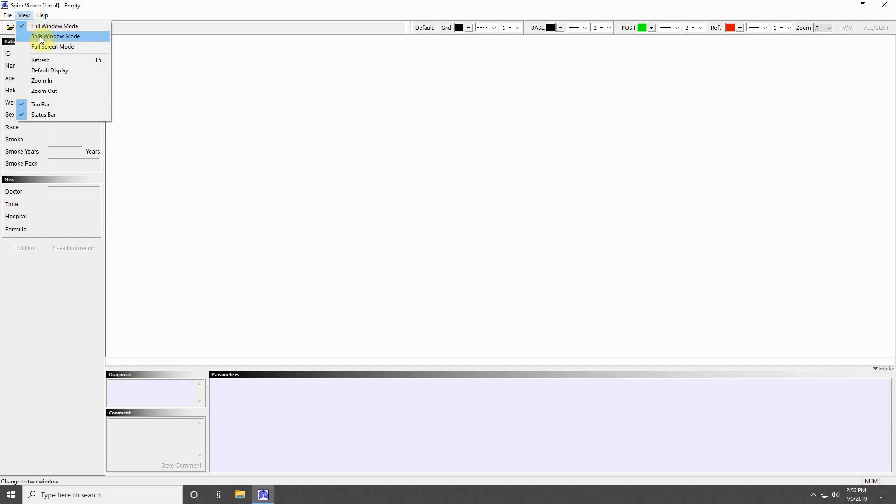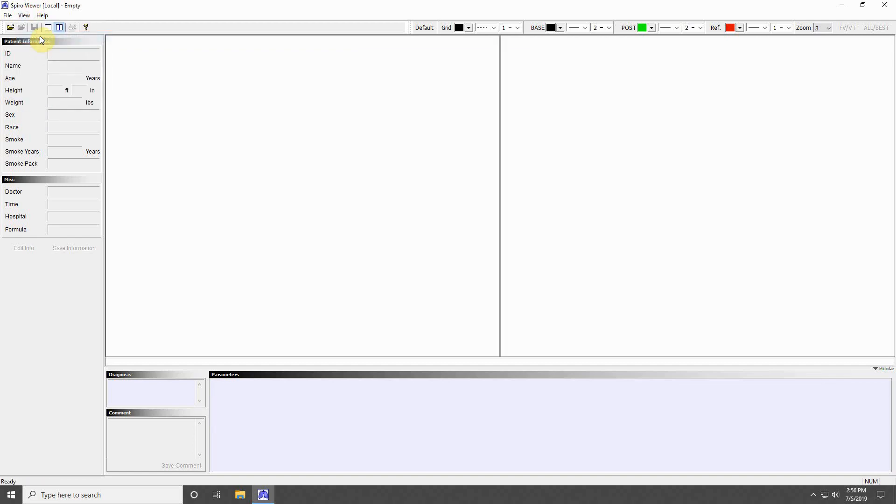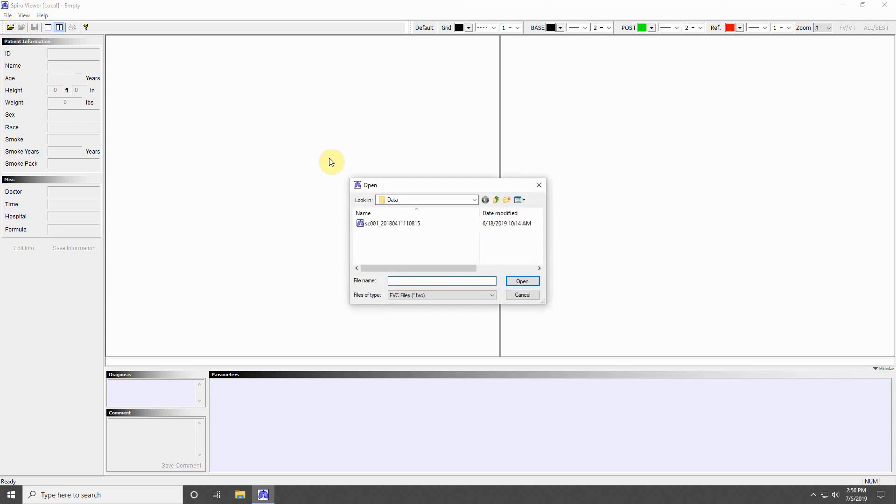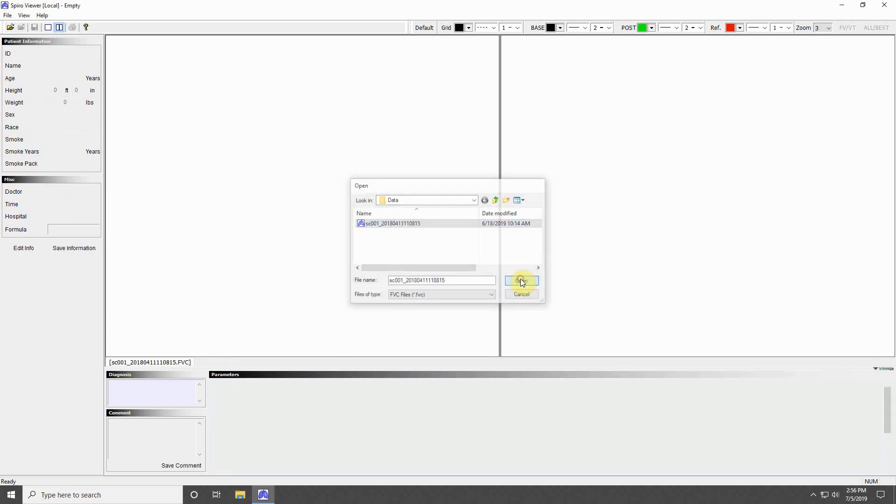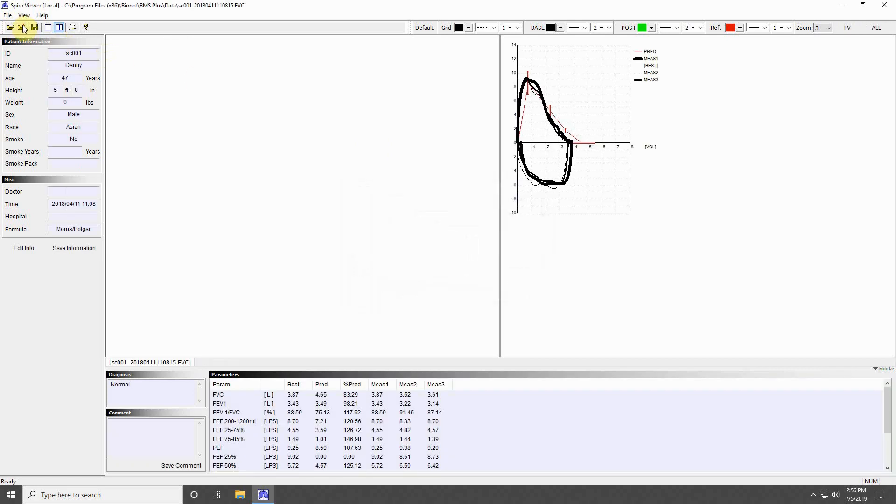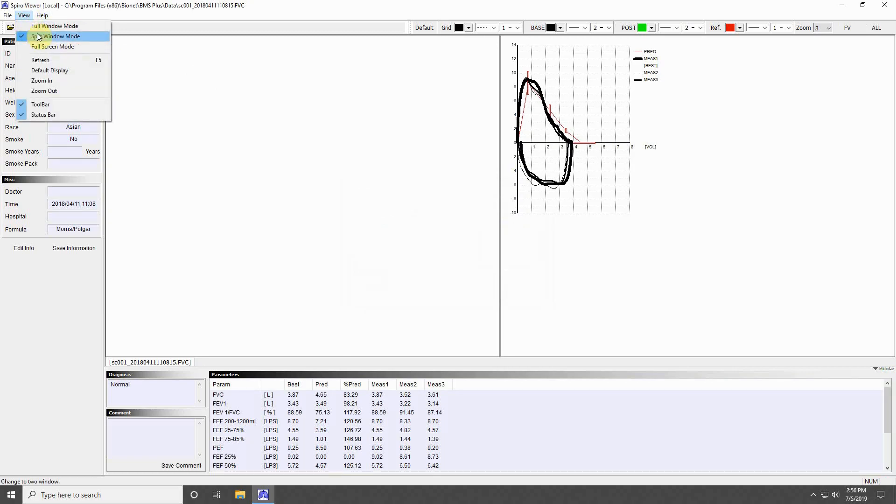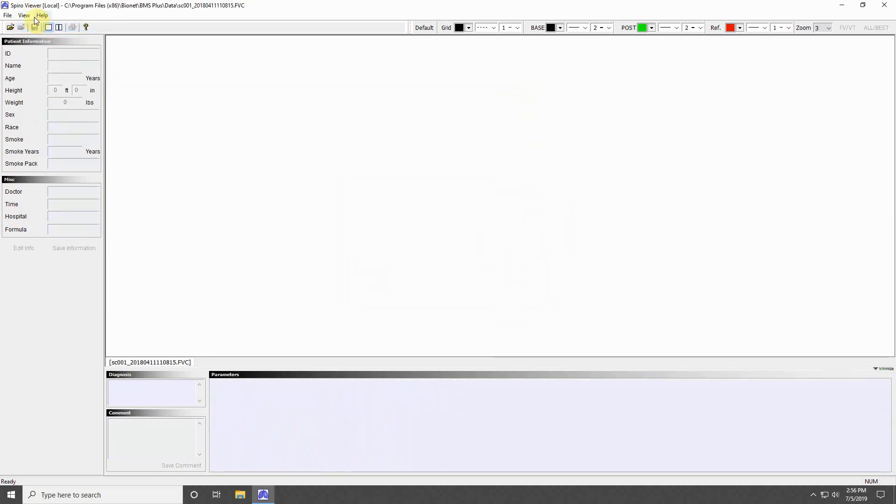Select Split Window Mode to allow the ability to compare two measurement files together. Click the new empty window that opened and press the Open button to select the file you would like to display in that space. You can return to a single window display by pressing Full Window Mode in the View menu.